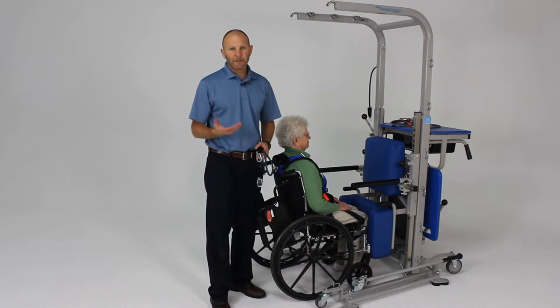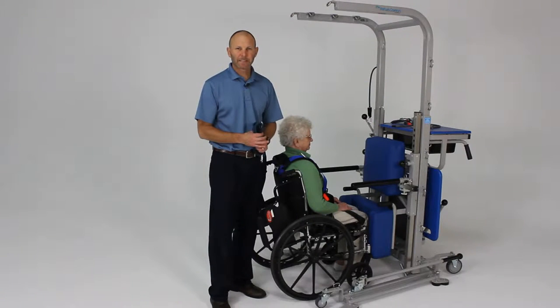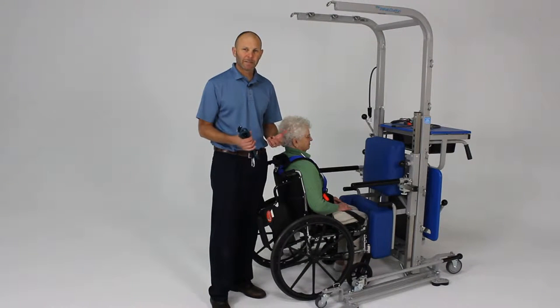I want to demonstrate the numerous functional activities you could perform with the rehab station. This is just giving you an idea of some of the different activities, starting from some lower level types of activities and progressing to some higher level activities.